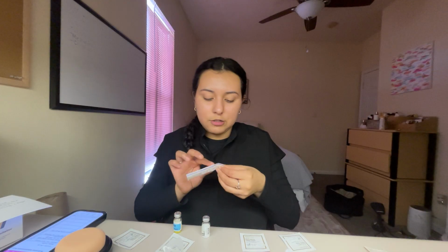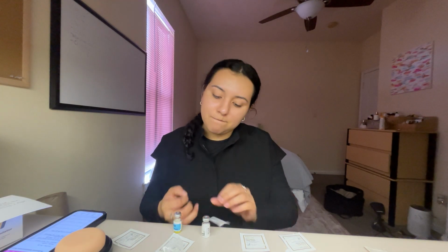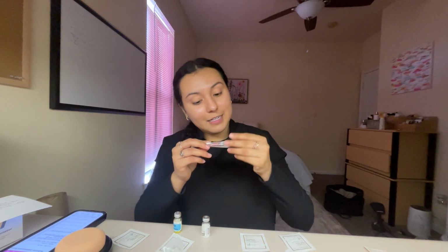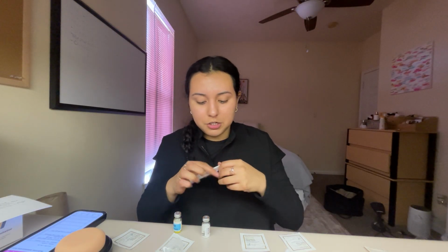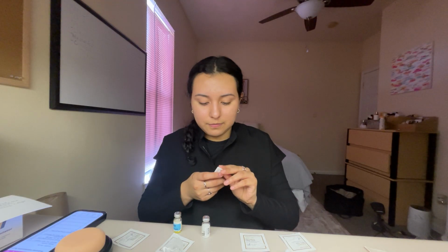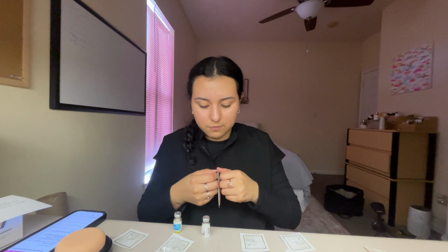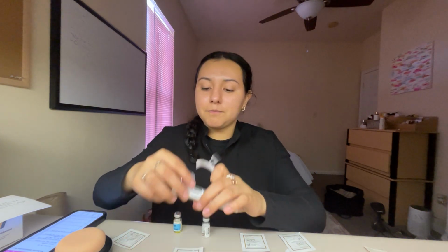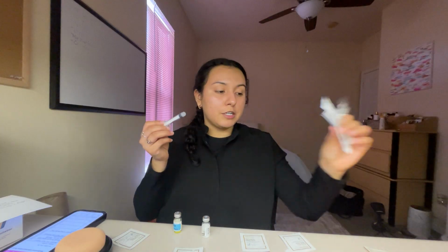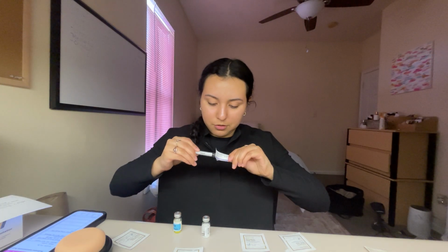And then I'm going to insert my 18 gauge needle. It's not wanting to cooperate with me. Or maybe it's me that just can't follow the directions. Okay, so we have that. We have our syringe. We're gonna throw that away. And then we're going to connect that.